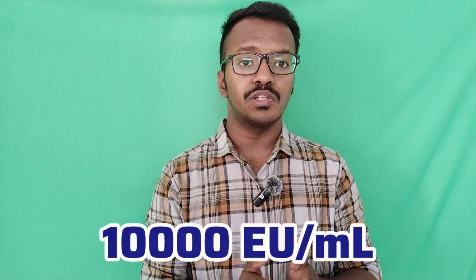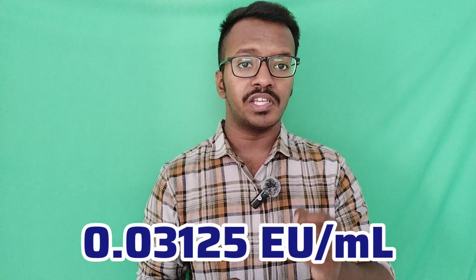Now please consider a controlled standard endotoxin of 10,000 EU per ml and lysate sensitivity 0.03125 EU per ml. Now we have 10,000 EU per ml of CSE. We need to reduce this concentration down to equal to our lysate sensitivity of 0.03125. For that purpose, we perform serial dilution of CSE to obtain the concentration range down to 0.03125 EU per ml.